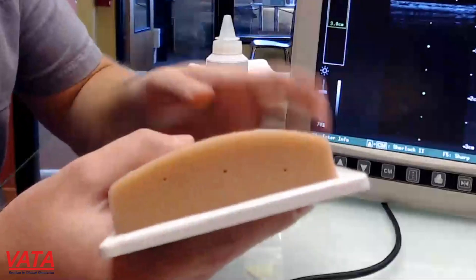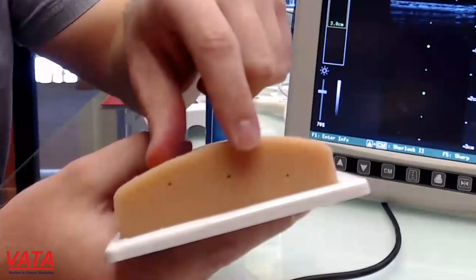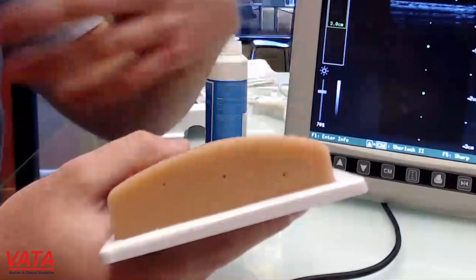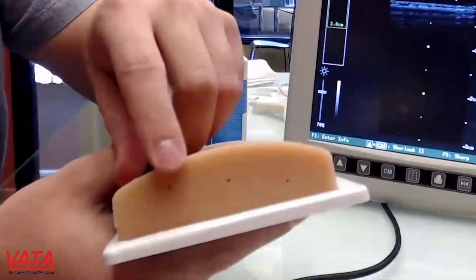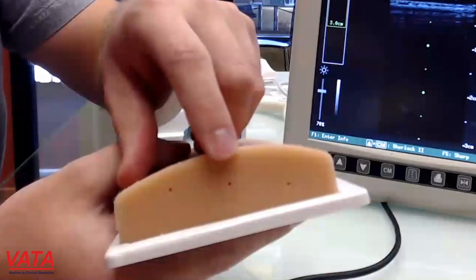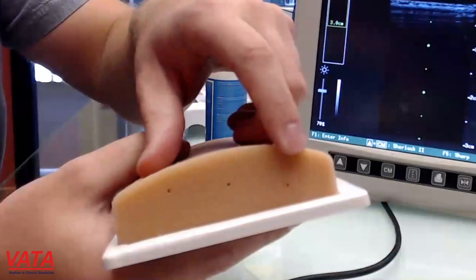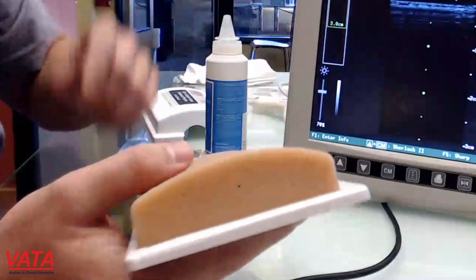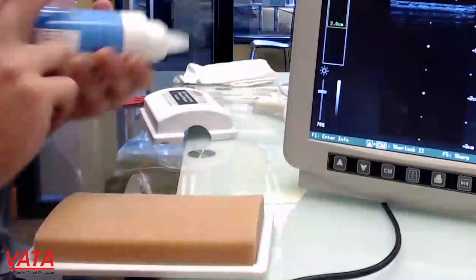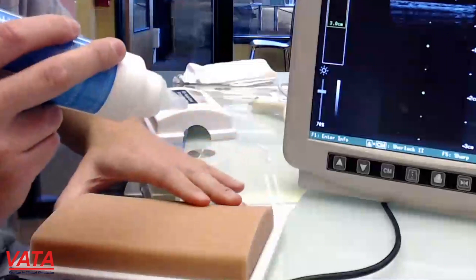On the end here you're going to see these little dots. Those dots correspond to the different veins — they're centered on each vein. This one over here is centered on that smaller superficial vein, this is our medium-sized bifurcated vein, and this one over here is our deeper vein. That gives each person a little bit of variety on accessing, just like on our 2365 model.